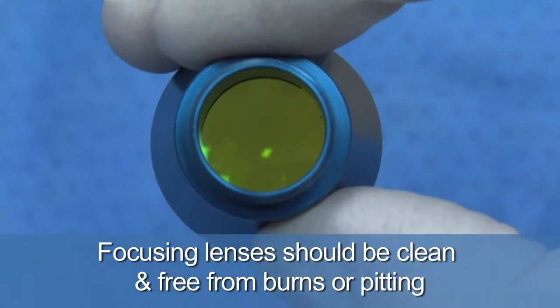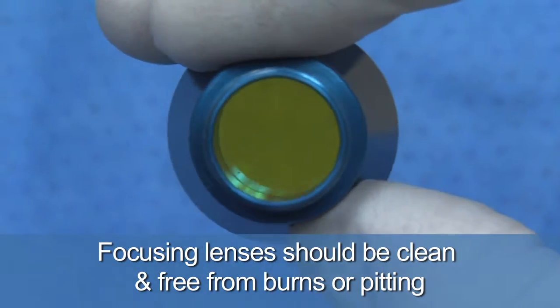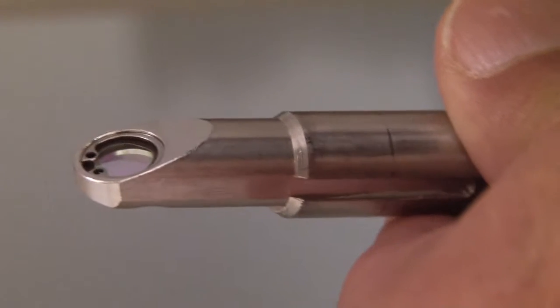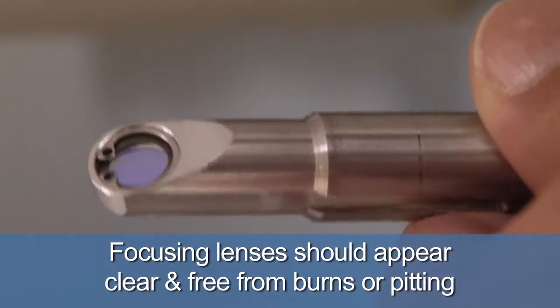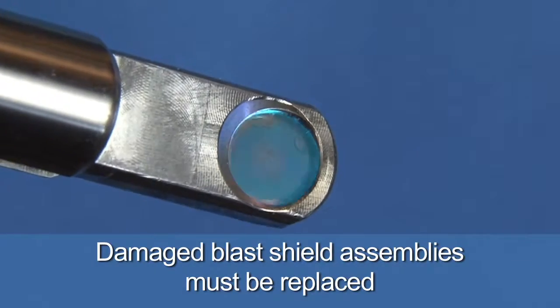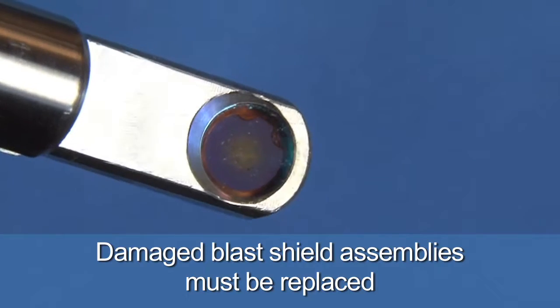It's also important that all focusing lenses be clean and free from burns or pitting. When using a Holmium laser, check the blast shield prior to using the laser. The blast shield is typically located proximal to the laser's beam aperture and prevents laser energy from being reflected back into the laser's energy source. The blast shield should appear clear and free from any burns or pitting. If the blast shield is burnt or pitted, replace it and dispose the damaged shield into the biohazardous waste.